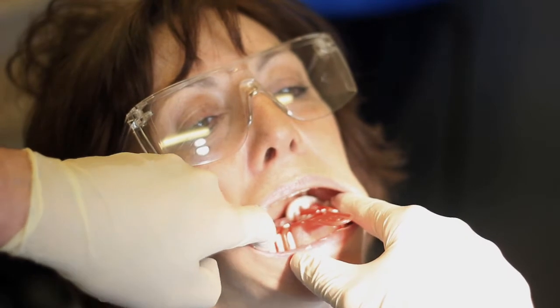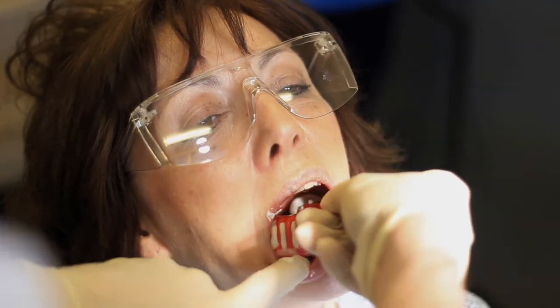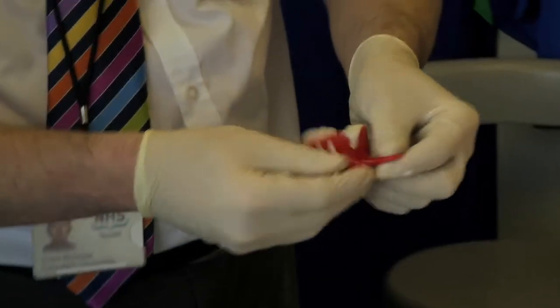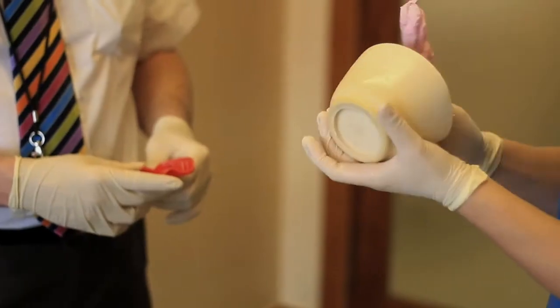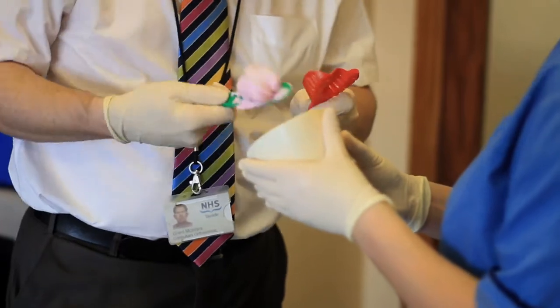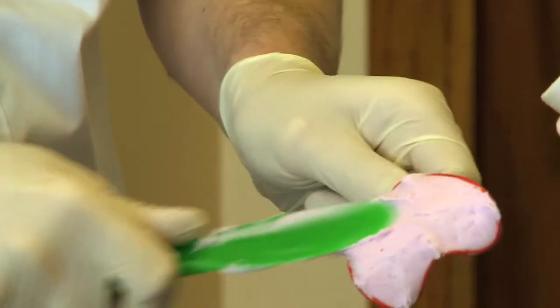That should be set fully now, so we're going to take the impression out now, okay? So we're going to use the handle just to lift it up and then press up from underneath and encourage the impression to come out all the way around. And then we should be able to see the finished impression. Press the impression material into the impression tray once again. Make it nice and smooth.